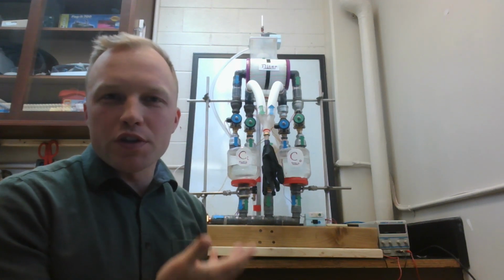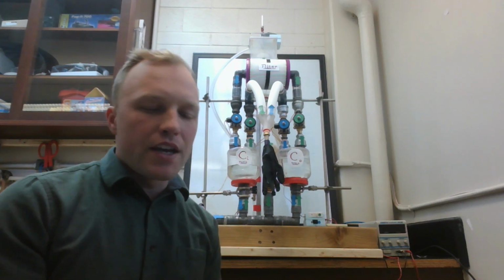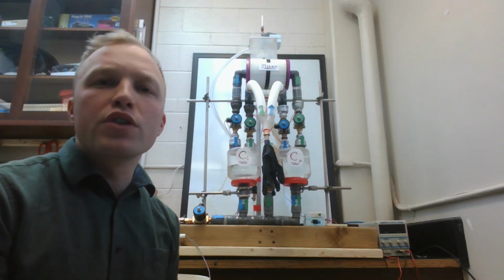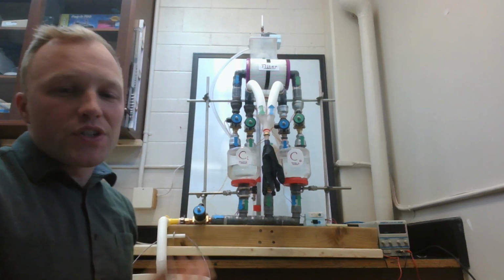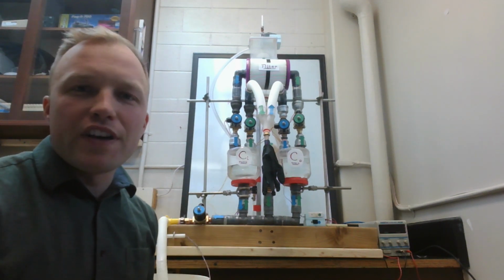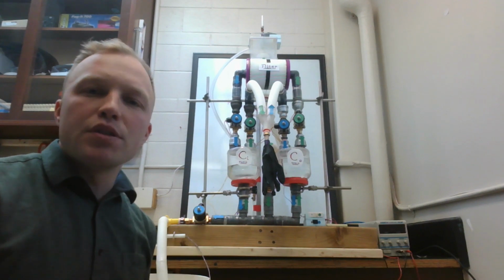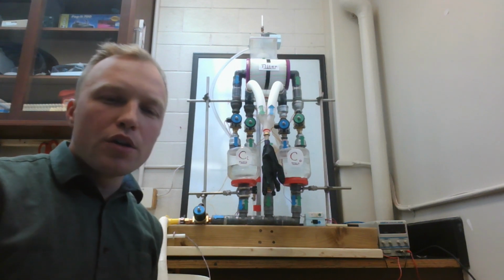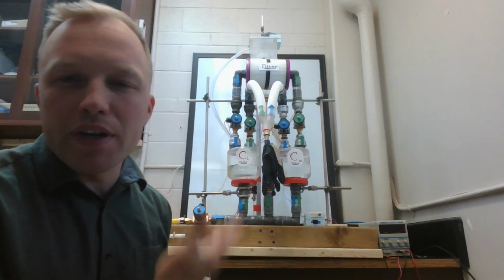This design challenge was brought on by the COVID-19 pandemic, where we have a massive shortage of personal protective equipment along with hospital supplies and machines like this, ventilators, life-saving support, not only in our own country, but around the world. So this machine is something that could be built by just about anybody using parts that are available at a local hardware store. And that was the kind of idea. Could we make something that was simple to make, used simple tools, was built inexpensively, and could be greatly improved upon, I'm sure, by many of the tradespeople out there who know a hell of a lot more about plumbing and electrical than I do.